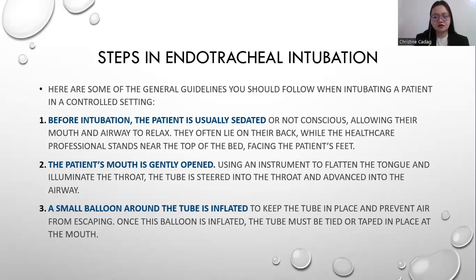So once the doctor has inserted the ETT, the nurse will inflate the cuff. This is to prevent air leak. And then after securing the position of the ETT and checking the lip level of the tube, it should be secured properly on the side of the mouth.